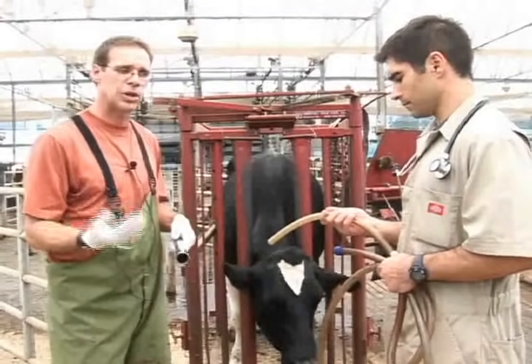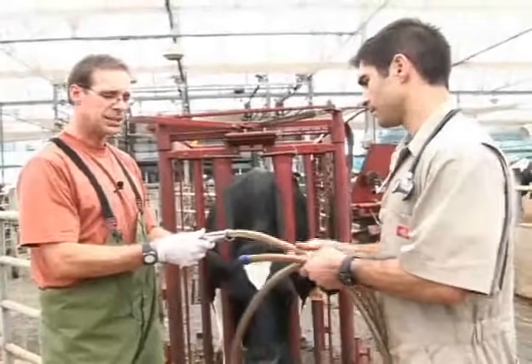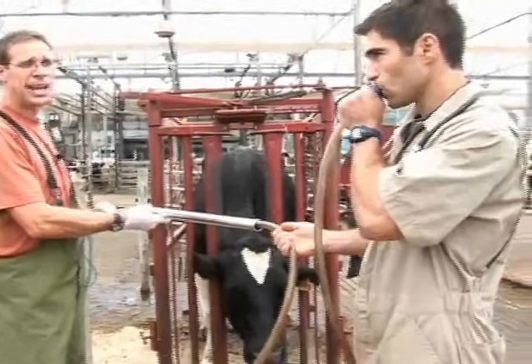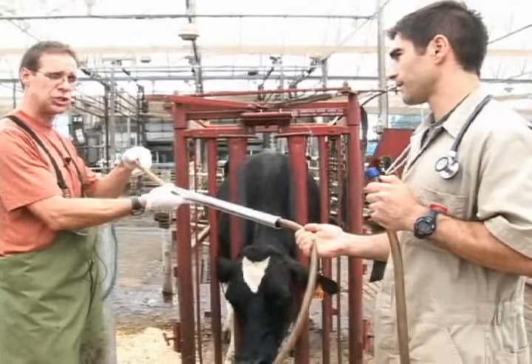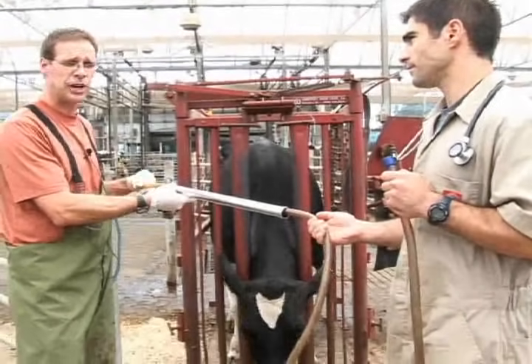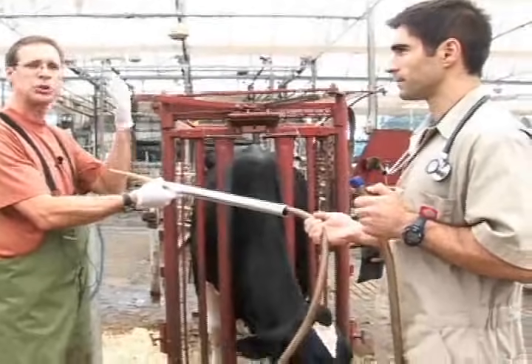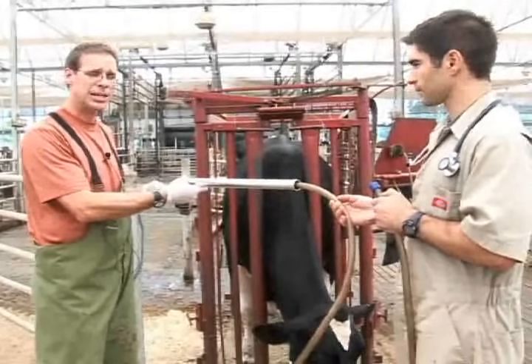To be very sure that's the case, you want to do your checks along the way. If the tube is in the esophagus, when you apply negative pressure — suction back onto the tube — the esophagus will collapse against the tube and not allow air to rush in, and you will feel something blocking the tube. That's your first good indication you're in the esophagus. If you're in the trachea and apply suction, air will rush straight through the tube and there will be no negative pressure — a good indication you're in the wrong place.